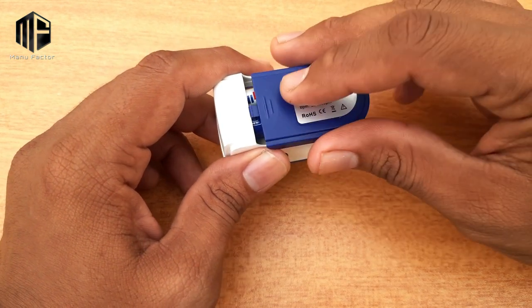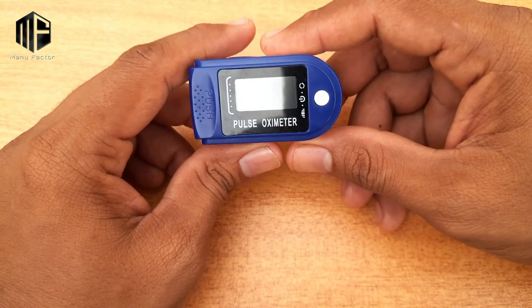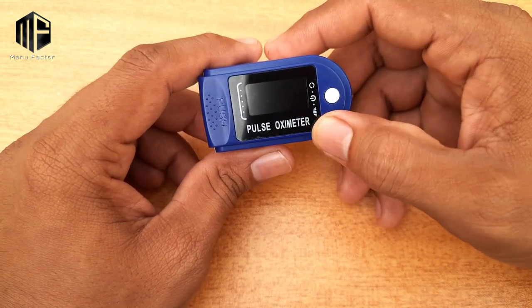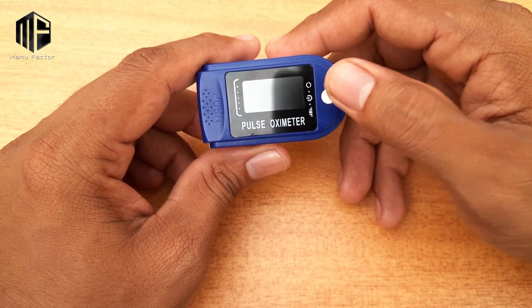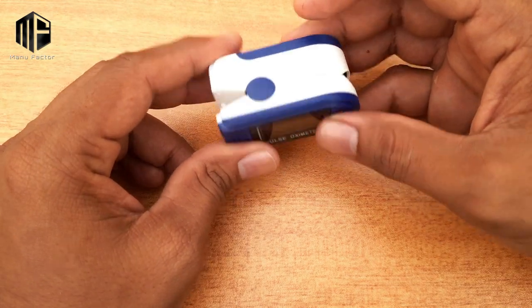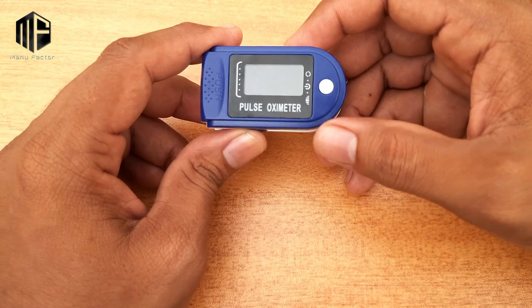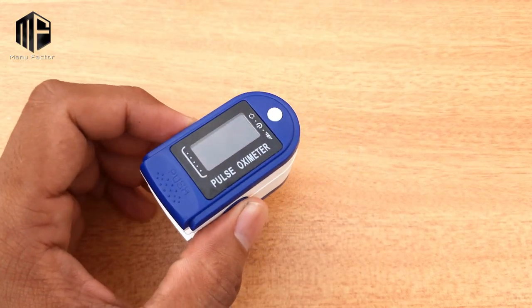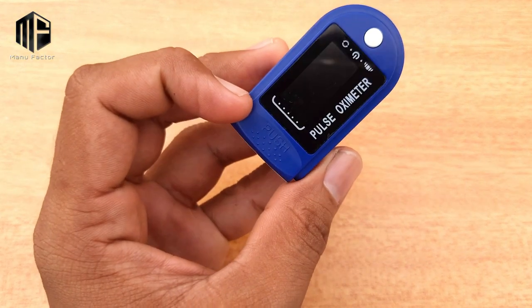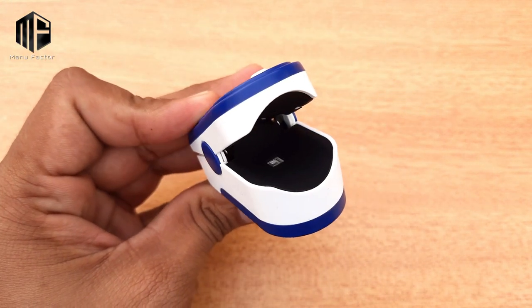There is a display on the pulse oximeter. There is a push button and there is a clip. There is a spring arrangement providing pressure. The operation is very simple — there is a push button, a clip, and a finger insert.